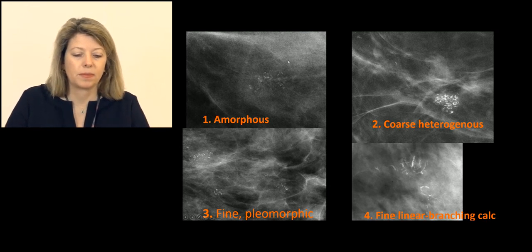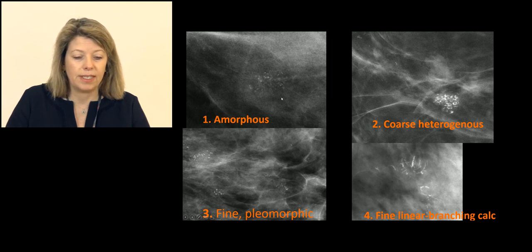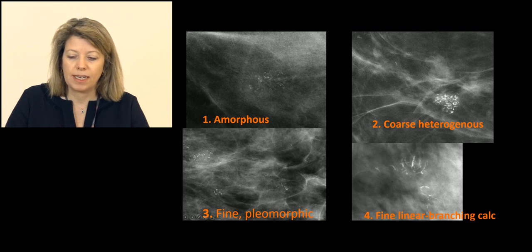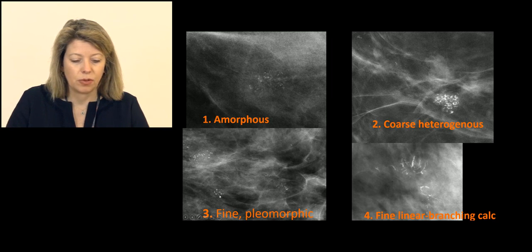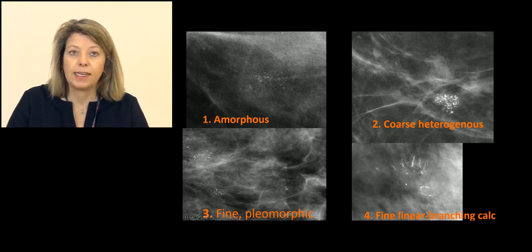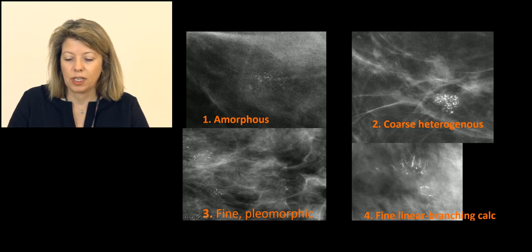Examples: amorphous calcifications with very low density and low size — suspicious, finally confirmed as DCIS. Coarse heterogeneous dense calcifications with irregular shape — also DCIS. Fine pleomorphic with several calcification clusters — all magnification views — with different sizes and orientations — very suspicious. Last image: fine linear branching with segmental orientation and triangular shape — typically malignant, suggestive of DCIS.